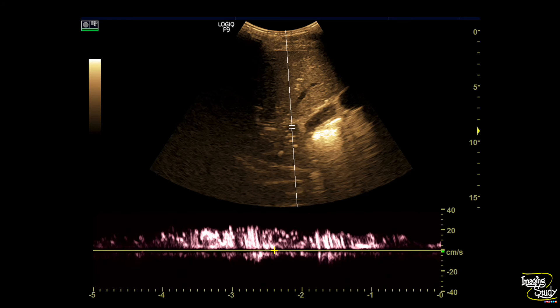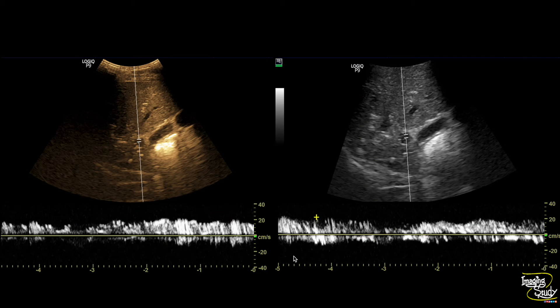Here we used the pulse wave Doppler. You can see spikes within the portal venous waveform, mainly in the direction of portal venous flow. In normal ultrasound you won't see this type of spikes within the portal vein — these appear due to high intensity transient signals.